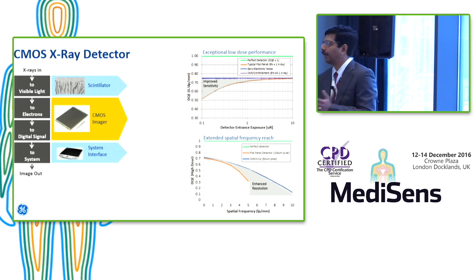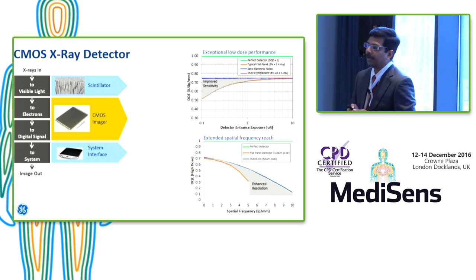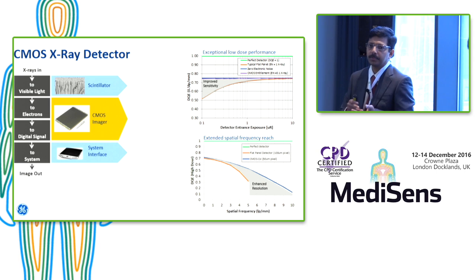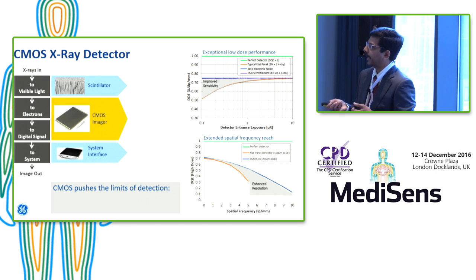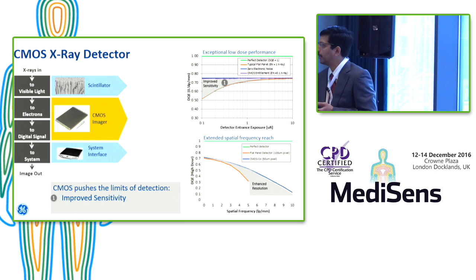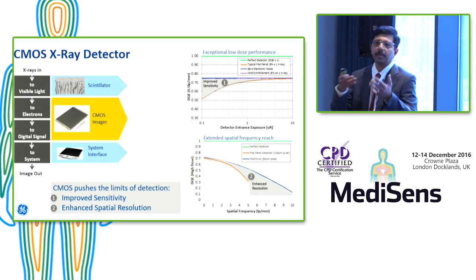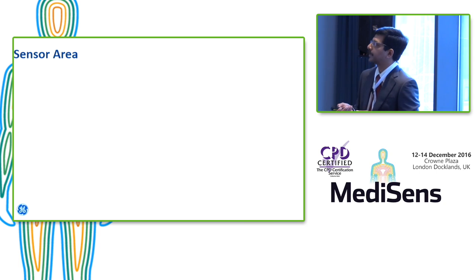But the real question is, okay, we have this extended range, this new domain. What do we do with it? I mean, what is the clinical benefit? That's a more challenging question. We need more work to understand that. Can we see more microcalcifications? Can we classify them? These are questions, it takes time. But first, we have to have the detector out there and test it. But we have this capability of doing that. So it's fair to say that it really pushes the limits of detection from two aspects. One in terms of sensitivity, and it also pushes in terms of the spatial resolution. We have to really work on what are the clinical and new applications that will come out of this.